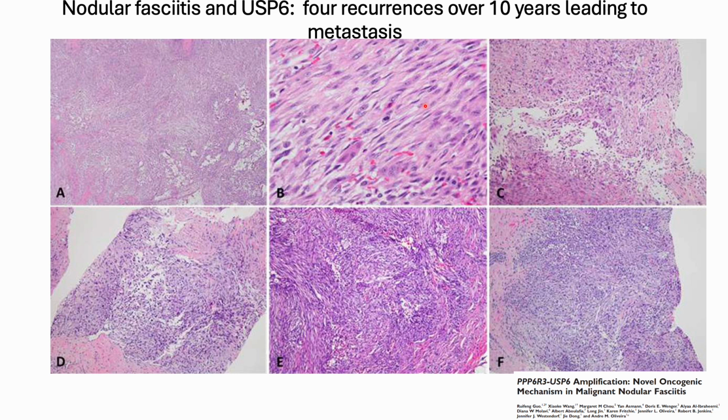So once you have a method of more accurately diagnosing a neoplastic entity, you can expand the spectrum based on that test and more accurately know the full spectrum of possible clinical behaviour. This case may be a bit different from a regular nodular fasciitis in that there was fusion, but there was also amplification of the USP6 fusion, which is not a common occurrence.